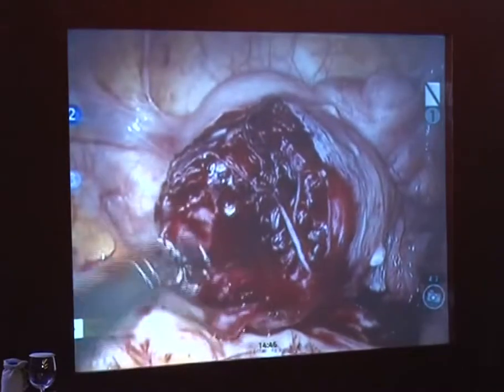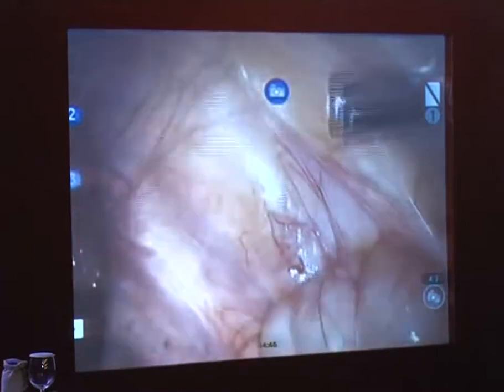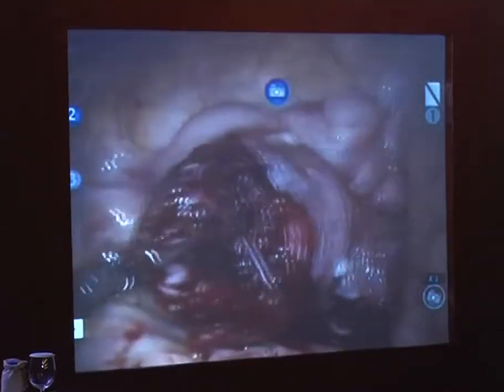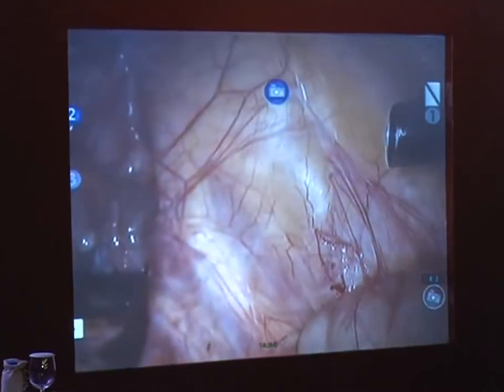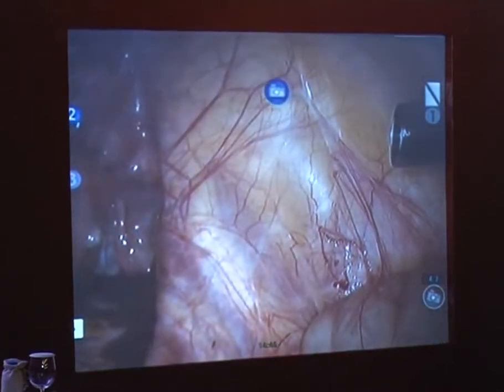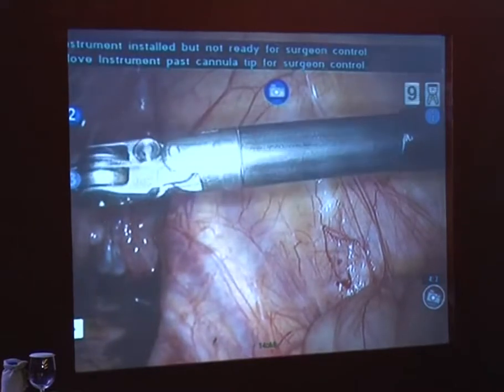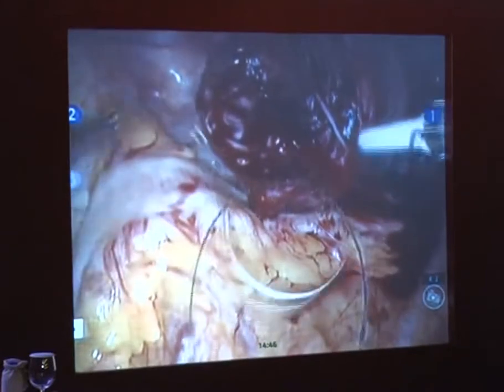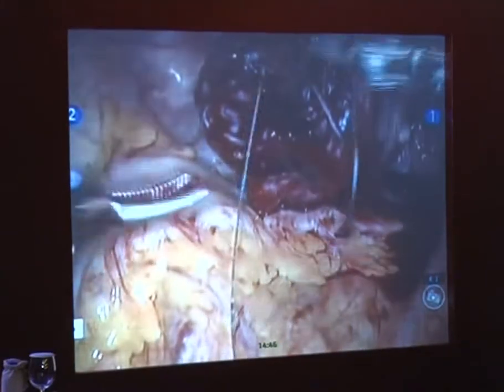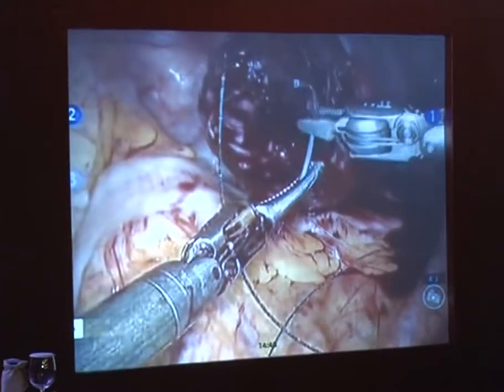Are there other fibroids anteriorly? Yes, there are. There's one right here. See? Right here. This is one right here. I'm going to have to open up the peritoneum to enucleate this one right here. So we'll address that as soon as we're finished. I'm going to get a full thickness bite here.